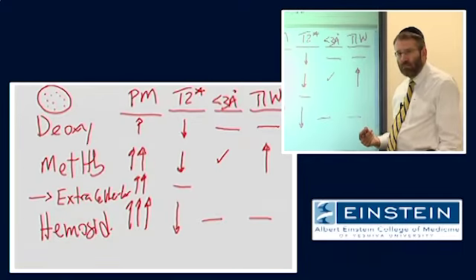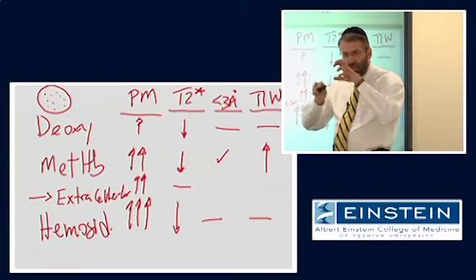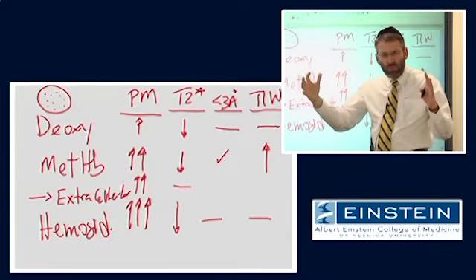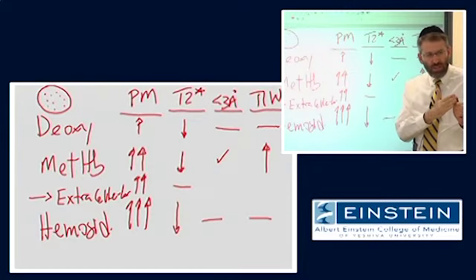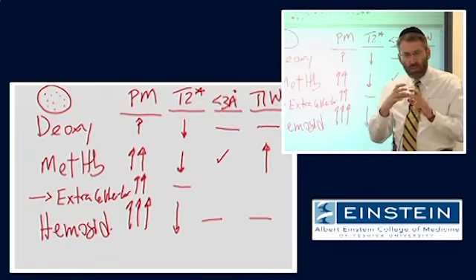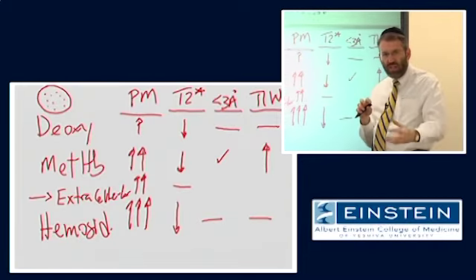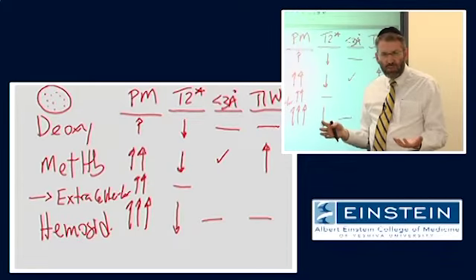And why is there only a gradient when it's intracellular? Because when it's intracellular, it's located in these pockets in the cells, but not in all of the intervening serum. So if you move across the whole volume of clot or tissue, whatever you want to call it, you move from areas with high concentrations of methemoglobin to 0 to high to 0 to high to 0. And this is all going on within a voxel. I mean, these red cells are tiny. So within a single voxel, we have components that have high magnetic susceptibilities and components that are diamagnetic. There's dramatic signal loss.